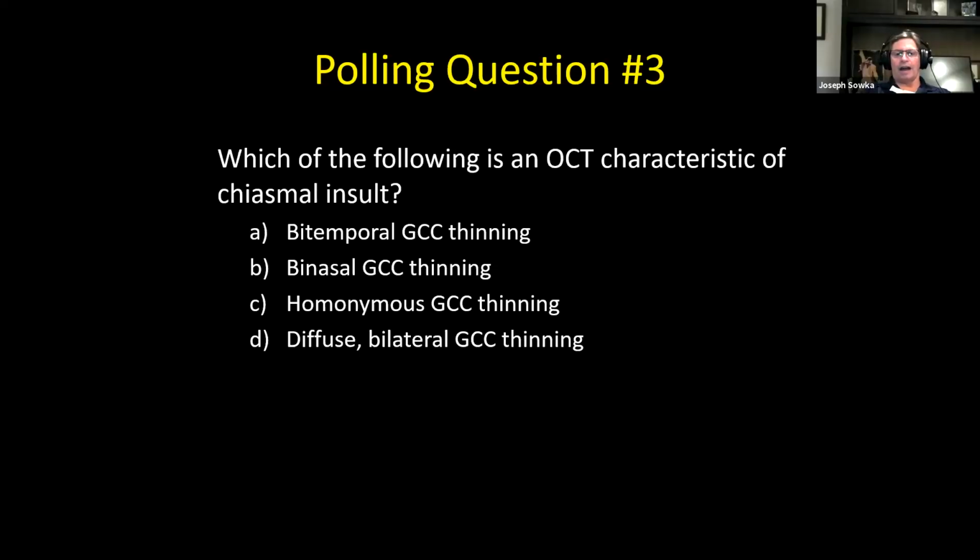Okay, I think we've gotten through, and we see that you really impacted learning. Binasal GCC thinning is the most common response. All right, great. So we jumped on that one. I guess we can move on.